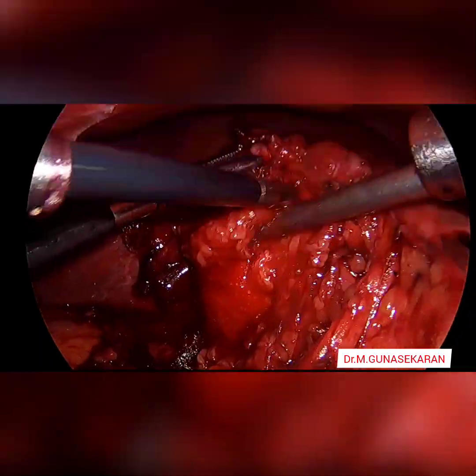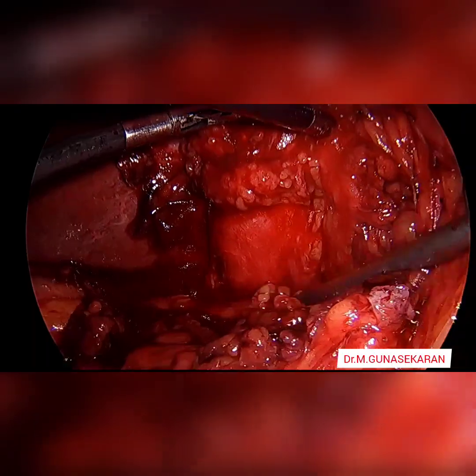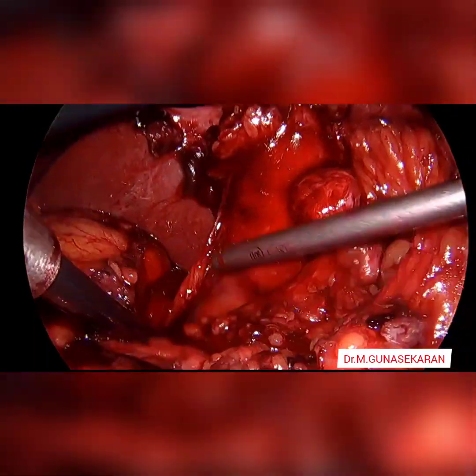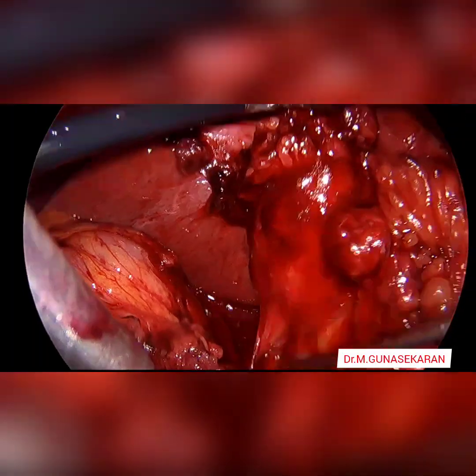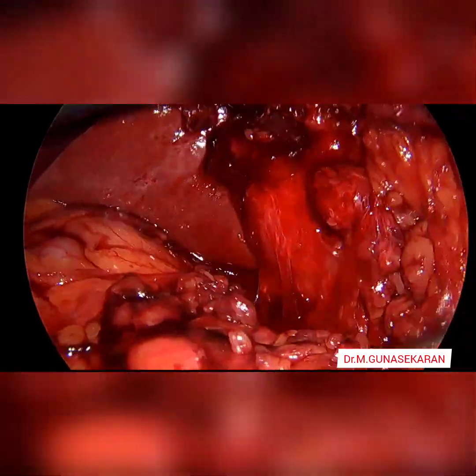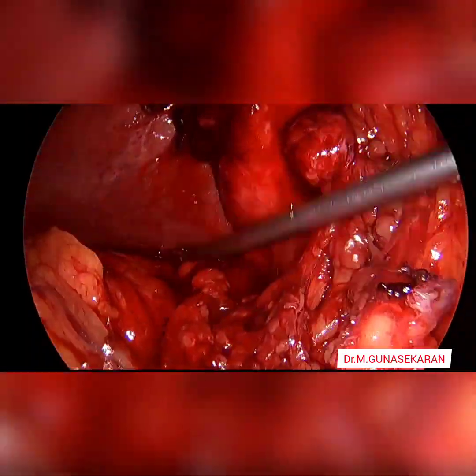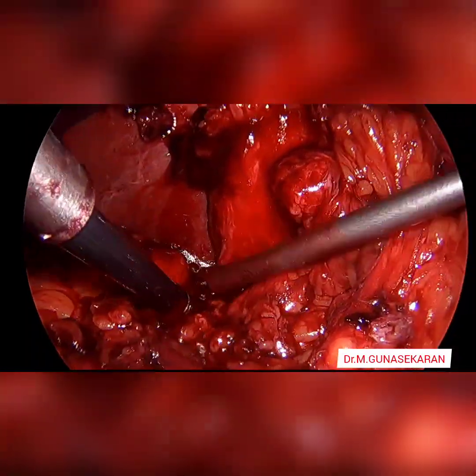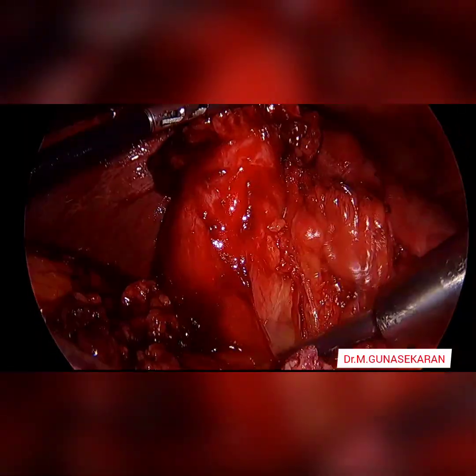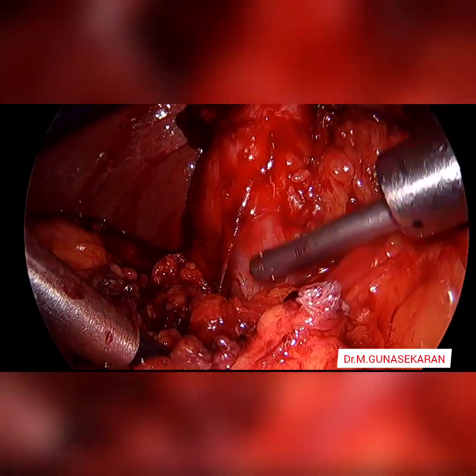You can appreciate that this patient has had multiple attacks of acute cholecystitis. In this situation, suction is a good instrument to dissect and release the adhesions from the gallbladder.